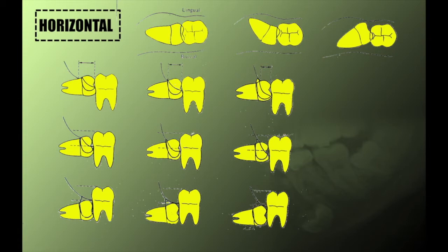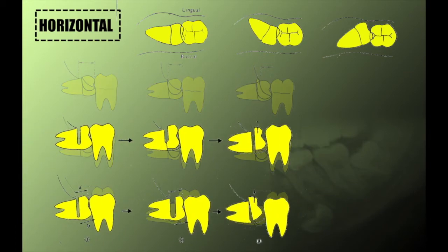For horizontal impacted tooth, as with the general concept of bone reduction, it varies depending on the depth and degree of impaction. The more embedded it is in bone, the more reduction it requires to reach application depth and hurdle past the large convexity of the crown. A reminder on sectioning, which is commonly done in horizontal impacted tooth.